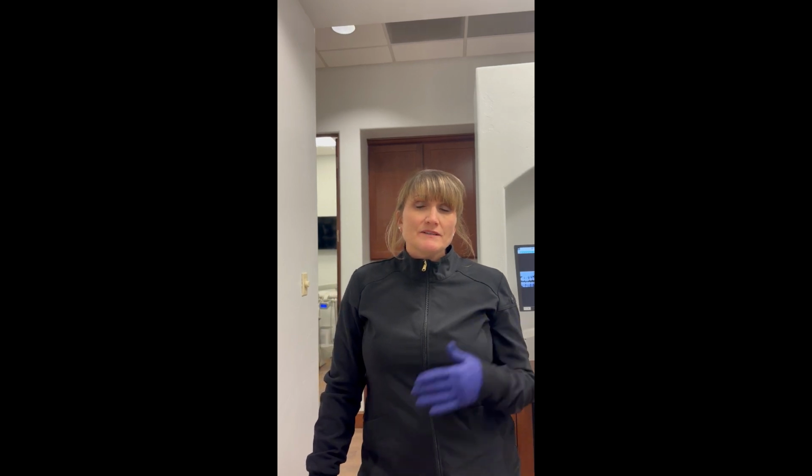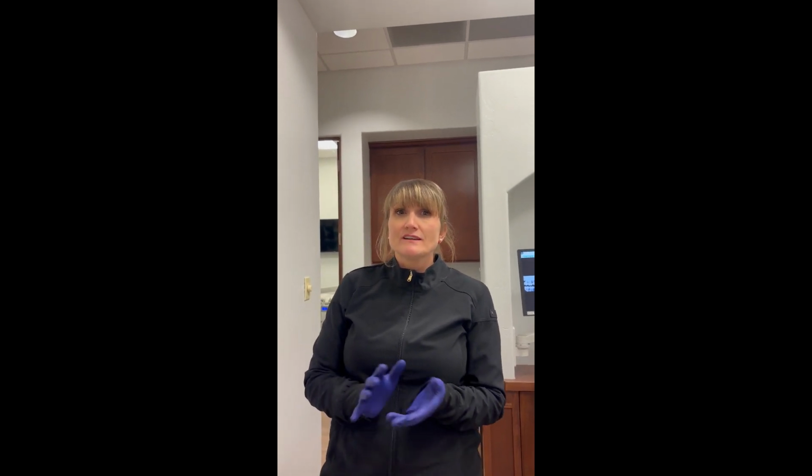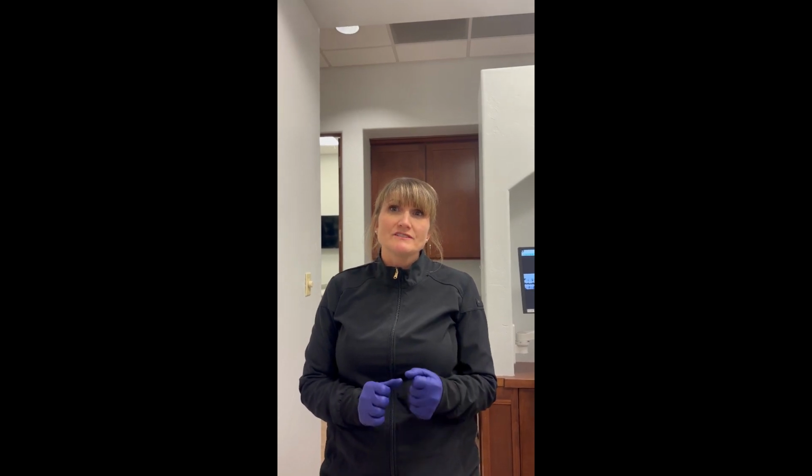Today I'm going to demonstrate to you how to take a bite wing x-ray. I would like to start off by saying first that taking a quality bite wing x-ray is crucial for accurate detection and observation of the teeth and the bone. I emphasize quality because a poor image can allow for missed issues that can affect the patient's health. It is important to understand what structures need to be in the image so that you can place the sensor and the x-ray tube or aiming cone of the x-ray machine appropriately.